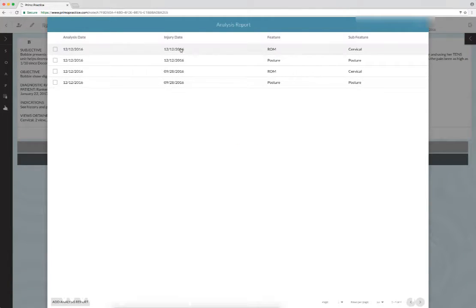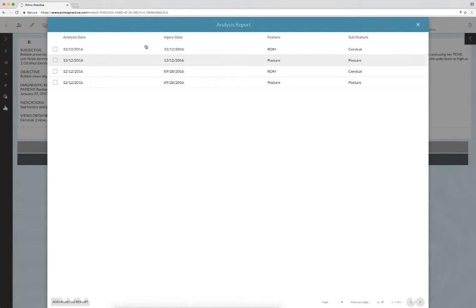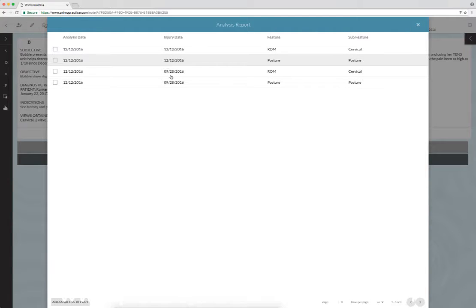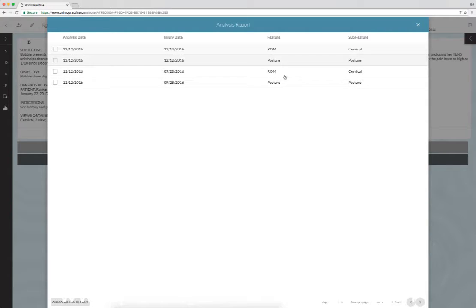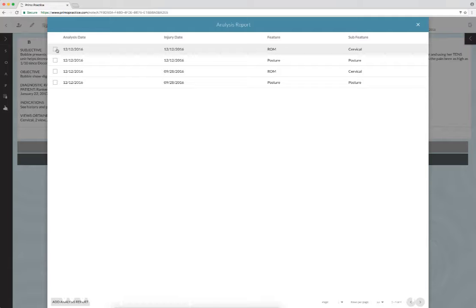That's going to bring up all the studies that we have done on Bobby's neck posture, range of motion, and x-ray as well. In this case there are no x-ray studies, but I'm going to insert this cervical range of motion. It could have just as easily been an x-ray report, so we'll click that.